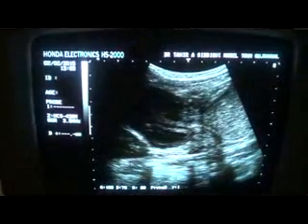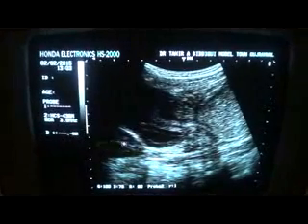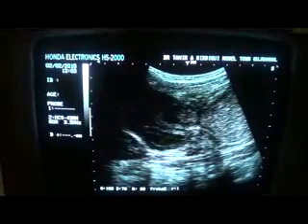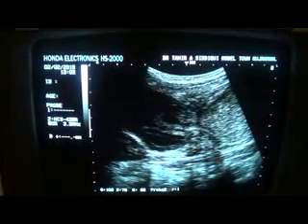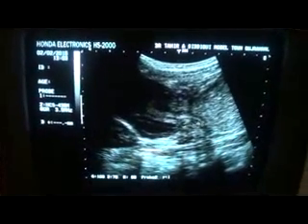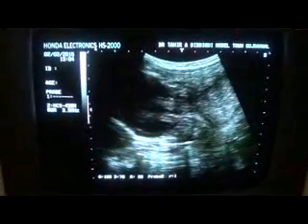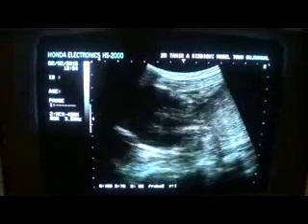In this view you can see the lower pole of the right kidney. This is the cystic part protruding from the distended bowel, this one in the right upper abdominal quadrant, with very meager peristaltic movement. This is the lumen of the bowel. This lumen can be that of this segment of the distended bowel that is hypoechoic and has echoes within it.